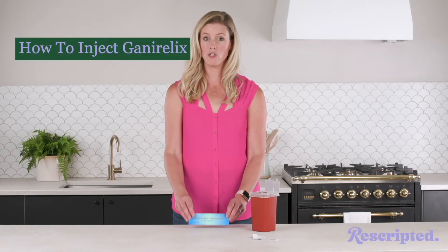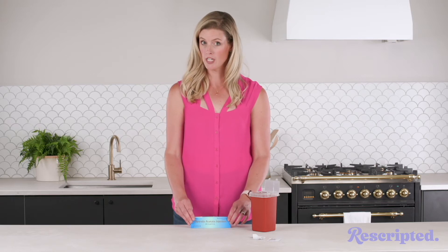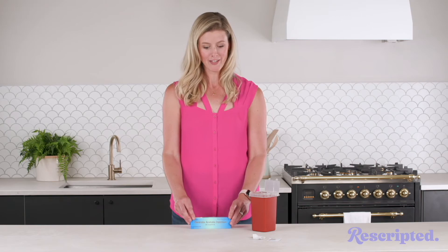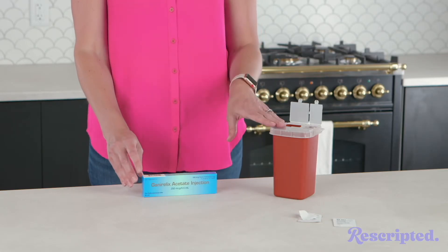Today we are going to learn how to inject Ganirelix. Get a pen, get some paper, you're gonna have to take some notes on this one. I'm just kidding, this one's actually one of the easiest ones there is. So all you're gonna need is your Ganirelix, some alcohol swabs, and a sharps disposal.